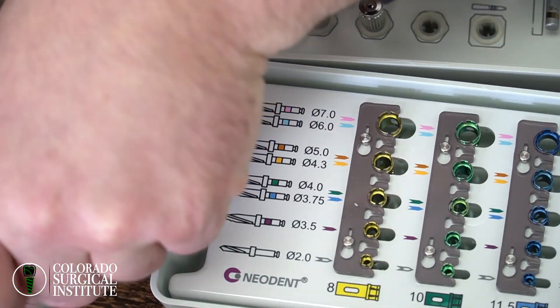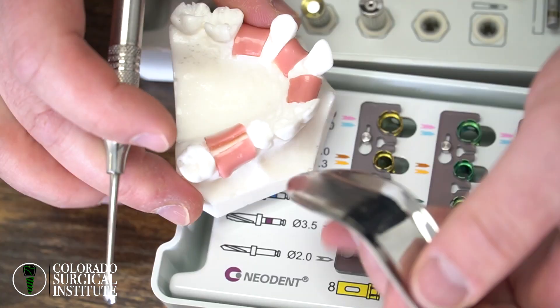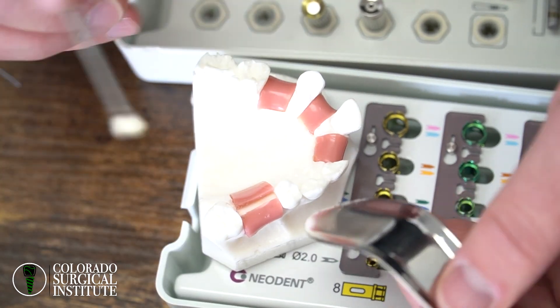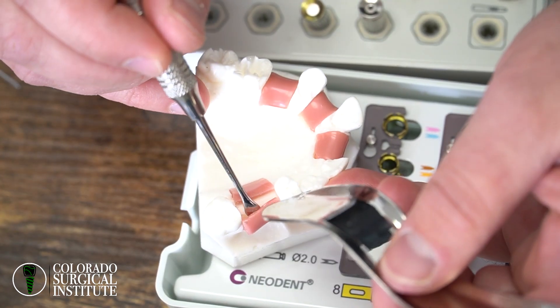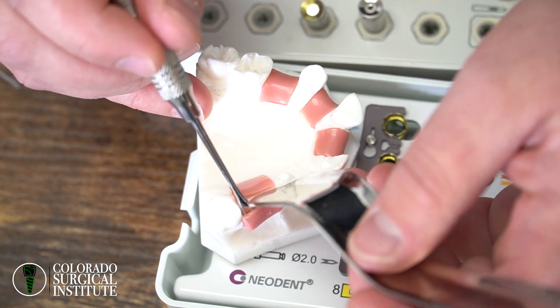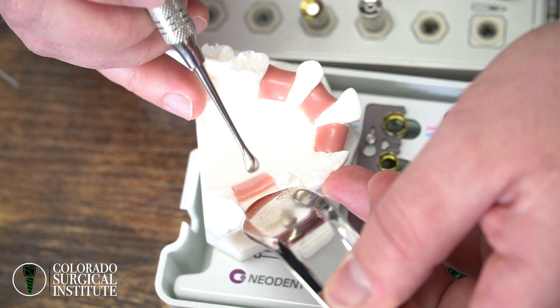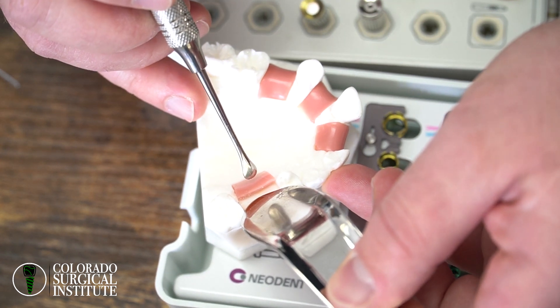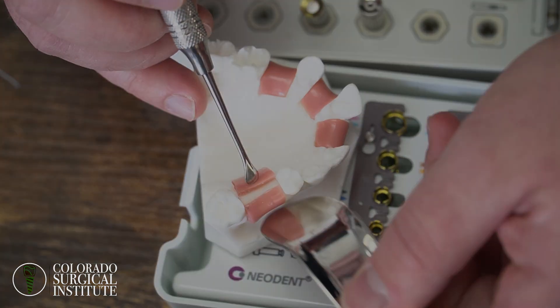When you're ready to start your drilling sequence, that's when your Minnesota retractor is actually going to be on the bone — not in the cheek tissue.